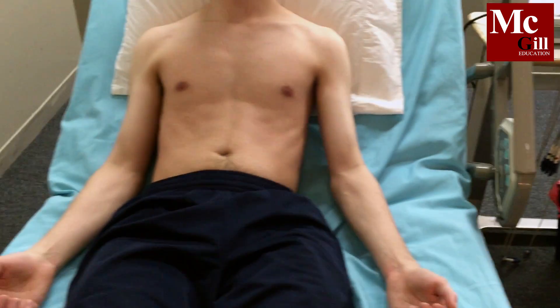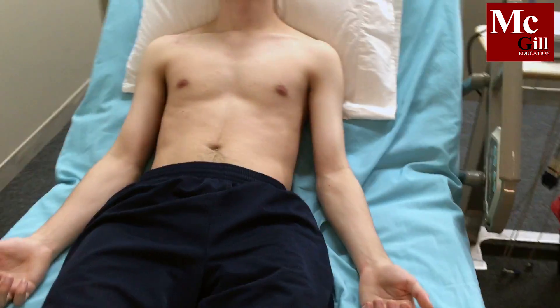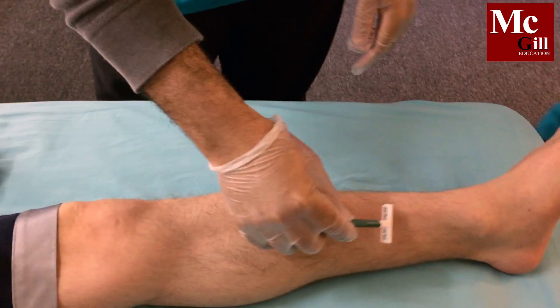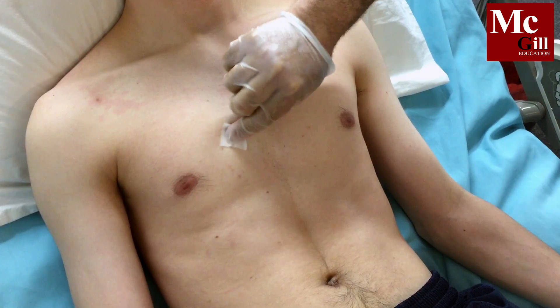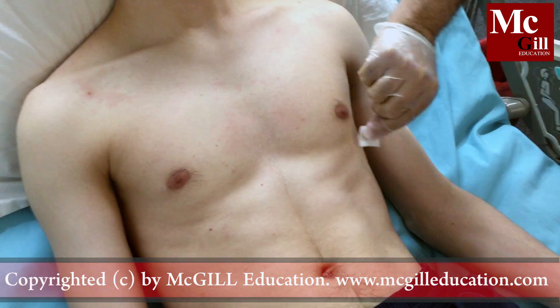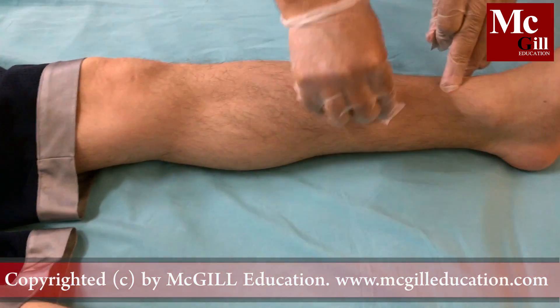Once the patient is positioned comfortably, prepare the skin for electrode placement. If necessary, remove excess hair, as excess hair will interfere with electrode adherence to the skin. Remove skin oil by wiping with alcohol sponges and allow to dry. Rub the area of electrode placement briskly with a 4x4 gauze pad to abrade the area slightly — the area will appear slightly pink. This removes dead skin cells, promoting better contact.